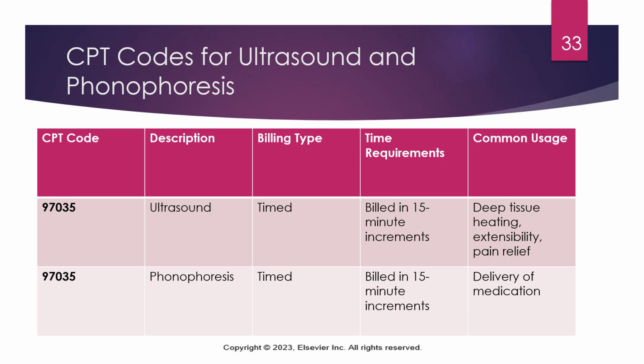And then you can see the common usage for ultrasound: deep tissue heating, extensibility, pain relief, add in soft tissue healing or modification of inflammation. With phonophoresis, just remember that we're delivering medications transdermally here.